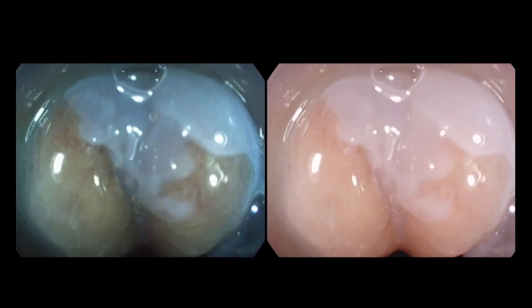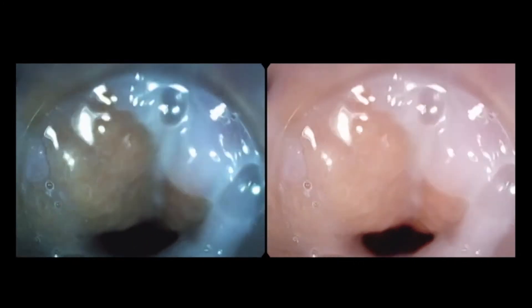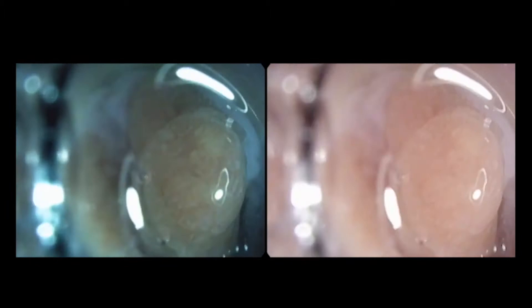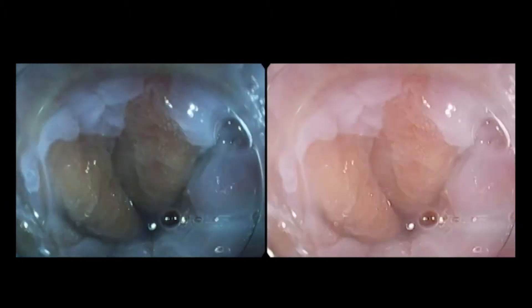The whitish acetic acid staining makes the surface structure more visible, and a short tongue of Barrett's appears on the left.